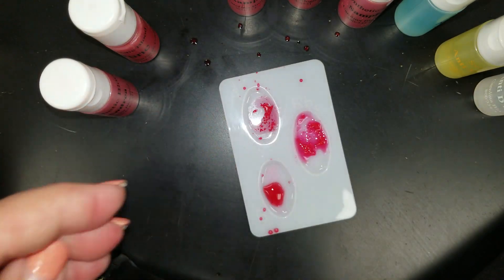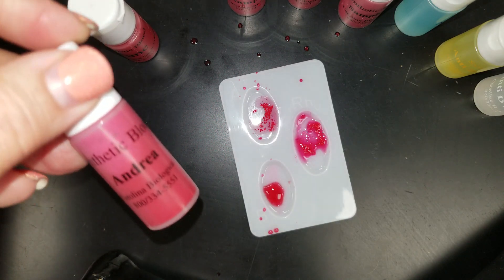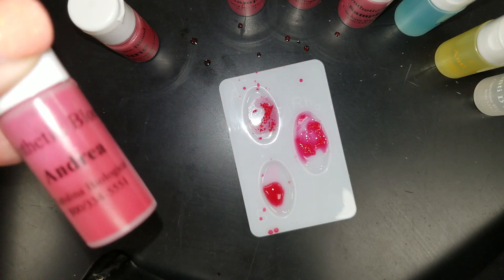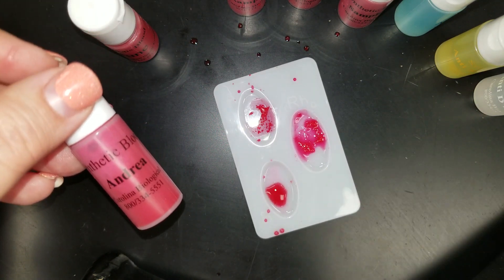So on your lab, you would write that Andrea had a reaction for A, she had a reaction for B, and she had a reaction for this Rh.